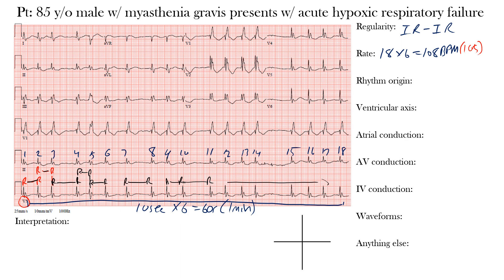Now let's look at the underlying rhythm origin. We can't make out any clear P waves, and the QRS complexes appear wide, so we may be dealing with a ventricular rhythm. However, because the rhythm is irregularly irregular, it's more likely we have some chaotic supraventricular activity. We'll say the rhythm is likely originating from a supraventricular source.